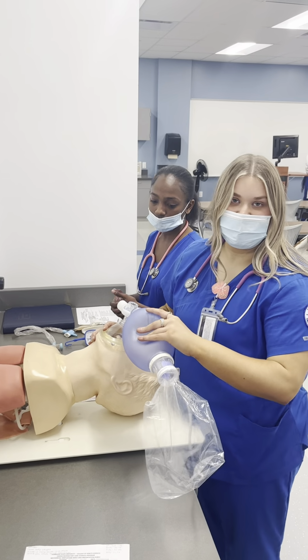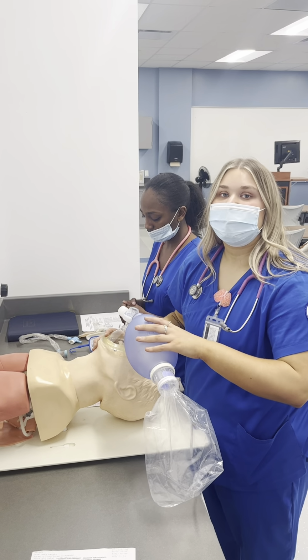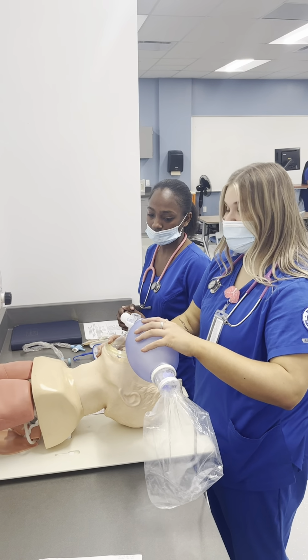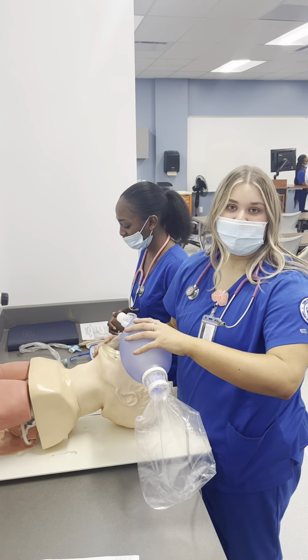Okay, so I'm pre-oxygenating this patient. We're going to be doing his intubation procedure. He's 80 kilograms, so we're going to have a 7.5, an 8, and an 8.5 size ET tube ready. I have Shelby assisting me, and we're going to go ahead and begin the intubation procedure. So I've pre-oxygenated the patient, and I'm going to get the scope from Shelby so that I can visualize the cords.